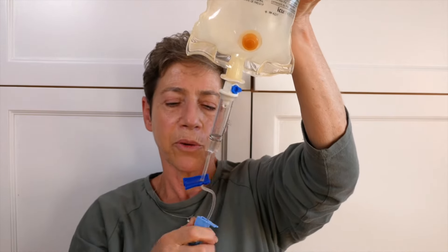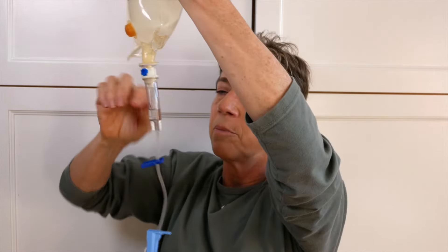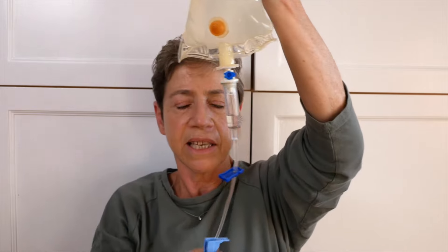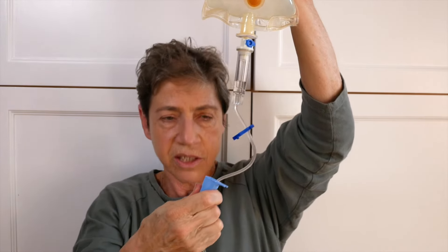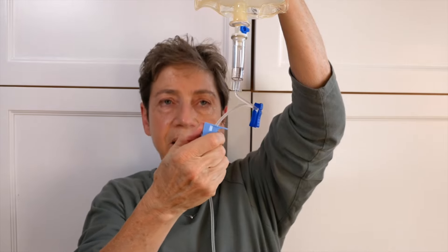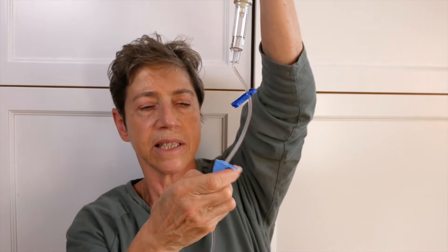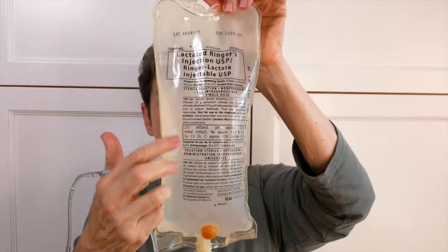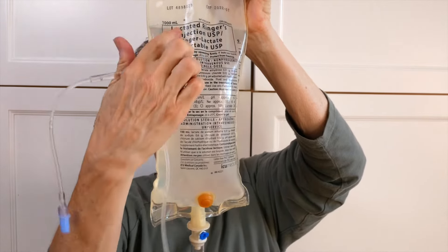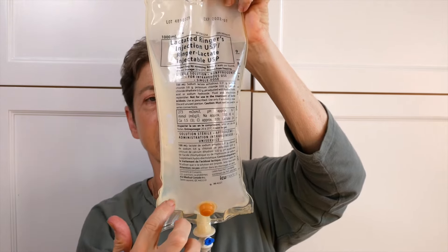You're going to end up with a wet lap if you let them keep coming, so you want to fill the bulb partway with fluids. Then you do need to fill the line with fluids, stopping by turning this dial when the fluids get to the very end of the line. You'll see that on the bag there are lines. This is a one liter bag, which means it has 1000 milliliters in it.